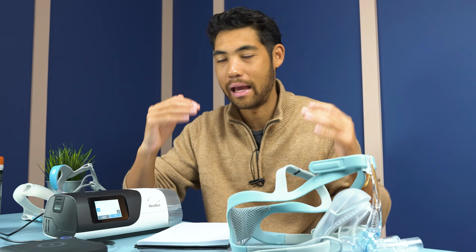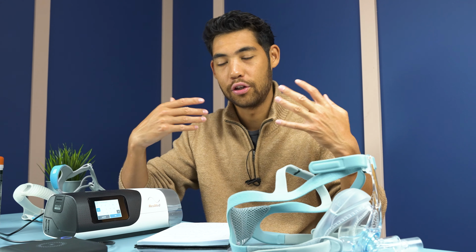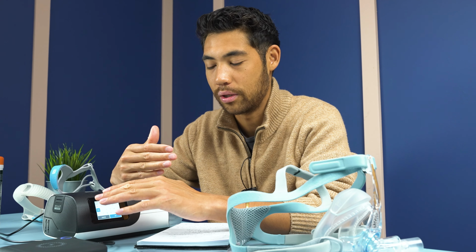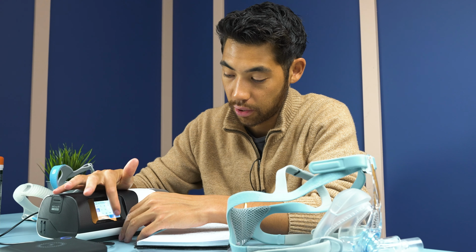And it's like doing anything for the first time. Going to the gym for the first time, writing for the first time, painting for the first time. You're not going to be very good at it. You're not going to be very used to it when you first start. So I recommend definitely starting at a lower pressure just so your body gets used to it. That takes about a week, and then you can go to your prescribed pressure. But definitely talk to your doctor before you start changing around the pressures.